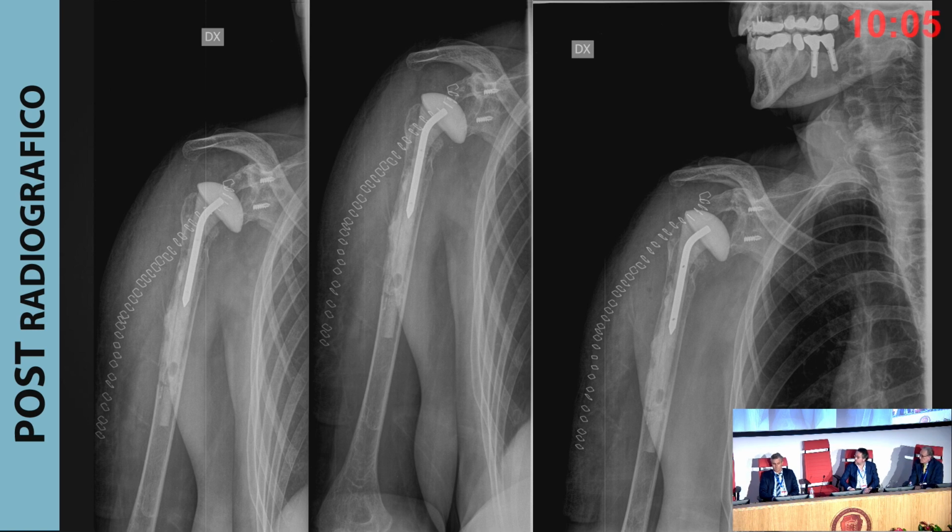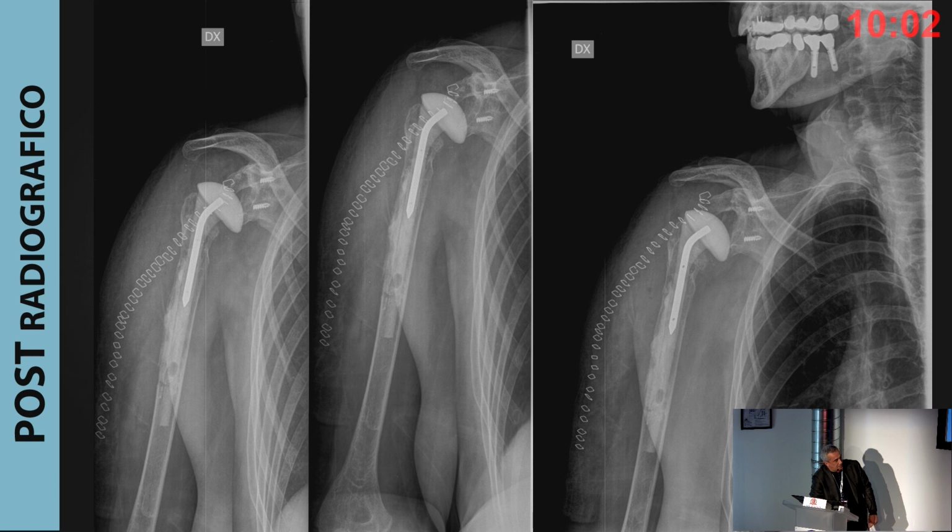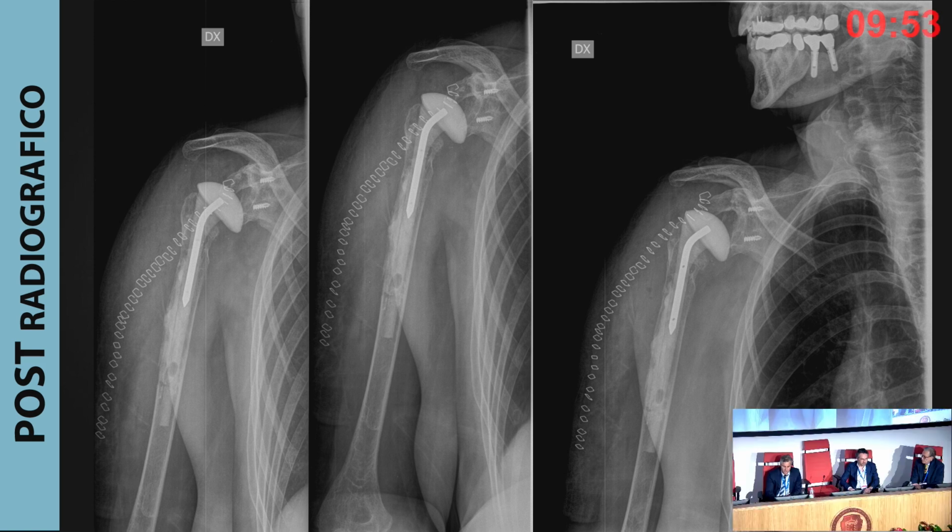Dr. Bright, how do you stabilize the stem in this? With some cement? Do you use press fit? What kind of stabilization do you want to achieve? I use an off-the-shelf stem that's prefabricated, and it comes in 3 sizes. And it's cemented, just cemented proximally around the metaphyseal region, so I don't put the stem down into the canal. And then it's stabilised by the cement and also the soft tissue rebalancing. So obviously I try and recreate the native humeral version, and then closing, I try and repair what I can of the soft tissue structures across the front.